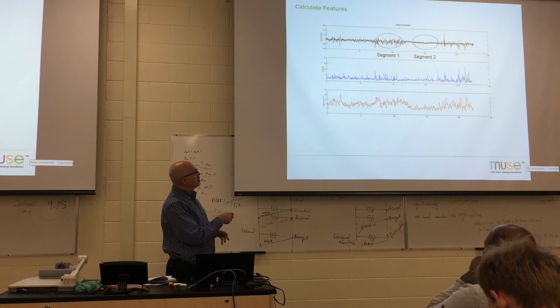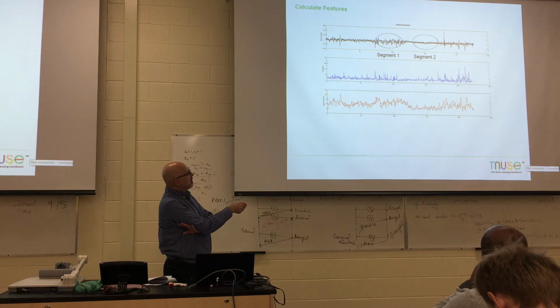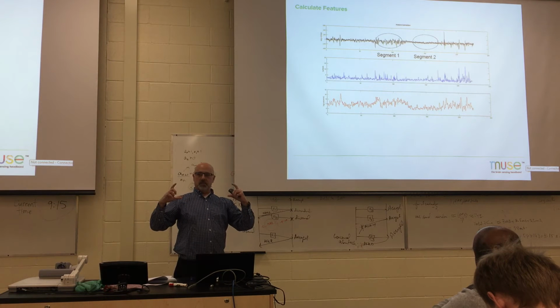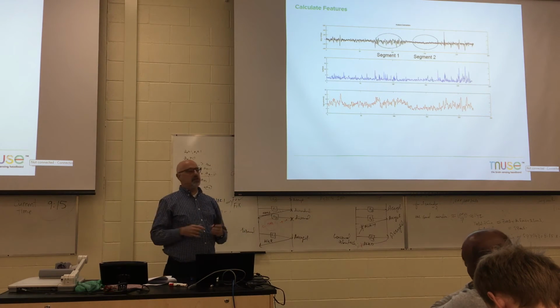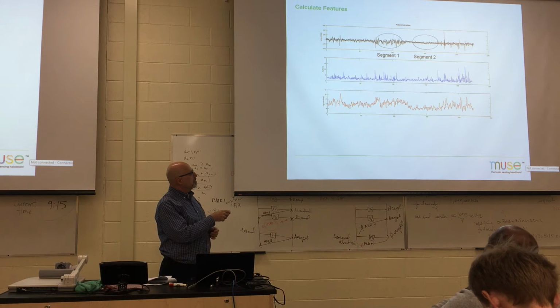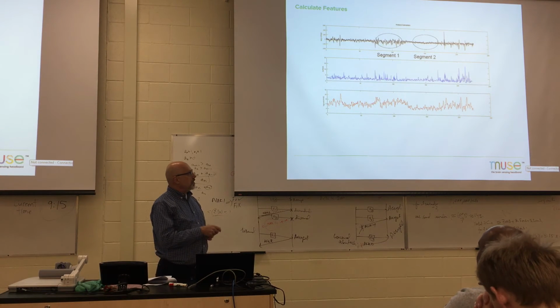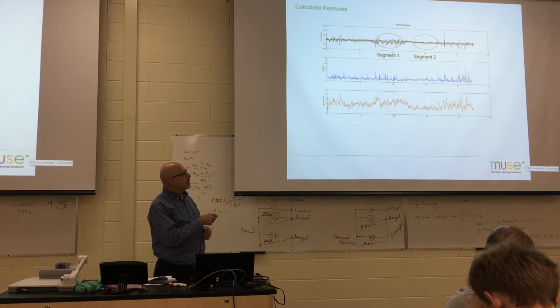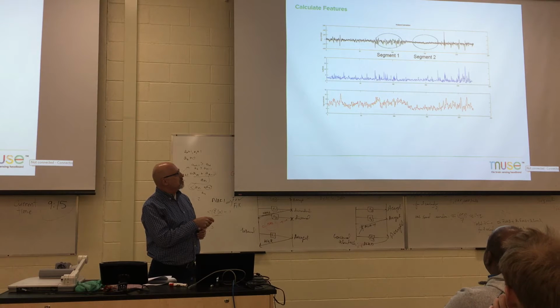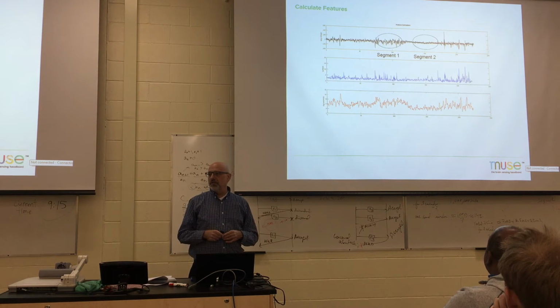So I calculated kurtosis and log variance of this signal, and we can see that there are a lot more peaks of kurtosis. High kurtosis means there are thicker tails in the distribution of those voltage values, and higher variance means there's more power in the signal. We can see here that in segment 2, the variance of the power of that signal is lower compared to segment 1. There are also more spikes in terms of kurtosis, but it looks more sporadic and hit and miss. So log variance looks like a more reliable feature for measuring whether this is clean versus contaminated EEG.